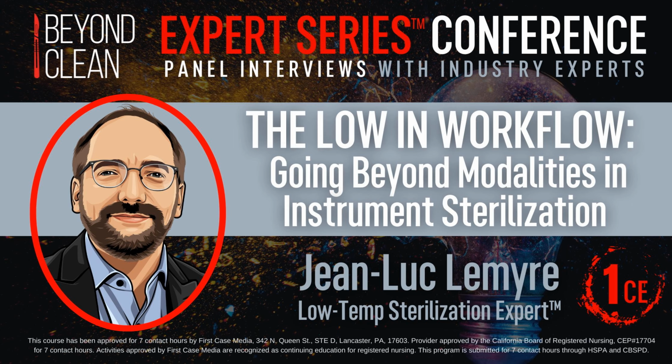Yeah, I mentioned surface, but I meant any accessible surfaces, and the lumen is part of it. Right, all of the interior of the channel is a surface. So yeah, lumens are open on both sides. With the initial vacuum of the sterilizer, you remove all the air, and after that, peroxide, as the pressure of peroxide builds in the chamber, can and will penetrate these lumens and sterilize up to the center of it. So that's good. Obviously, in the sizes that are validated for the specific sterilizer and cycle. Yeah, for sure.